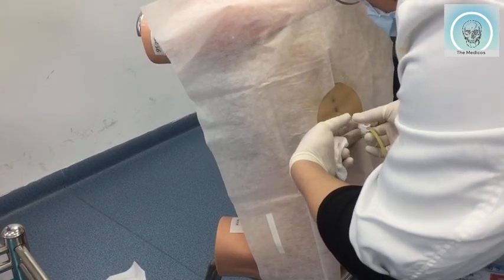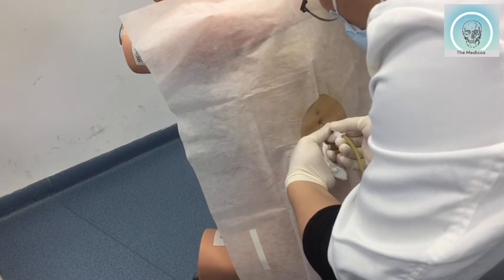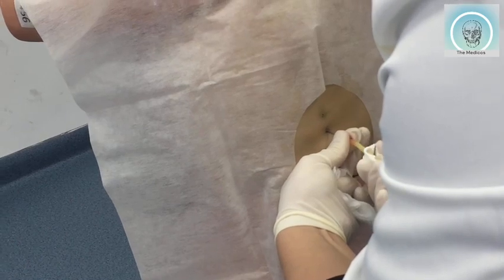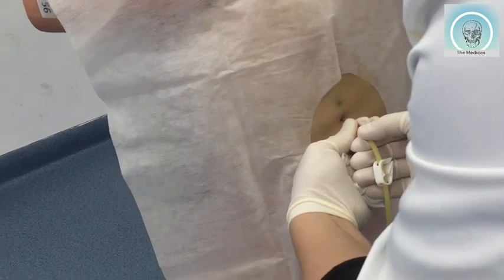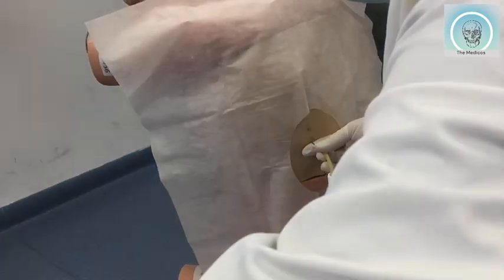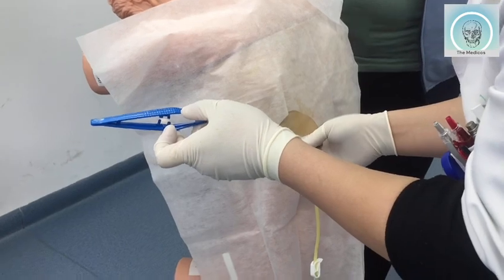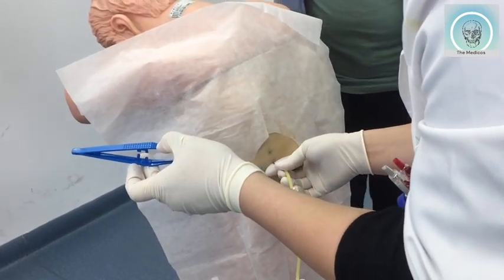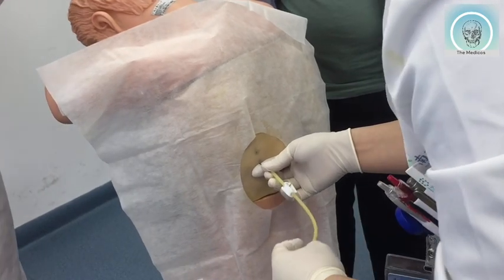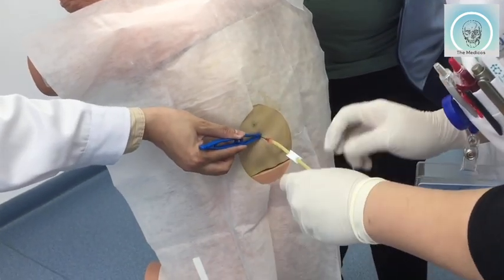And also direction. Also, watch the hand, okay. This kind of hand, okay. Here. So to make your hand steady, okay? Hand stand. Right. Okay, assist. So I should put on the glove at the same time. Then I can assist. Okay. So pretend I have put on the glove. Okay. I will hold this here.